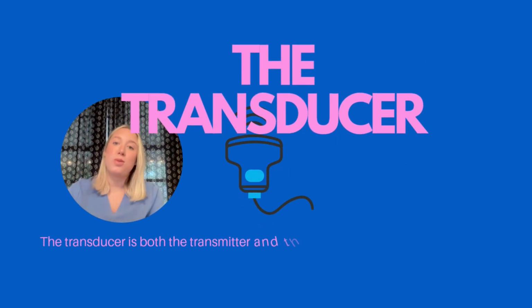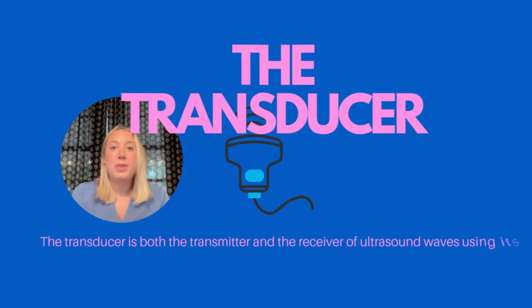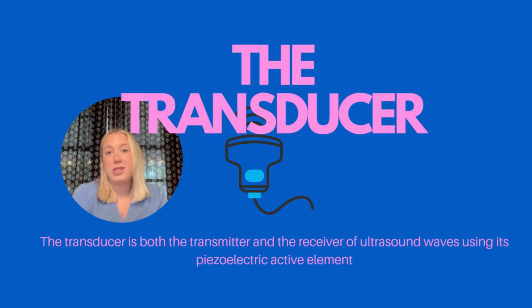The transducer is the core of the ultrasound system. It acts as both the transmitter and the receiver of all the sound waves through what's called the piezoelectric effect. When electricity is applied to the piezoelectric crystal, or what's called the active element, it sends high frequency sound waves into the body. Those sound waves reflect off different tissues, and then the same crystals detect the echoes and convert those back into electric signals, which allows the transducer to both create and collect ultrasound data that ultimately forms the image.